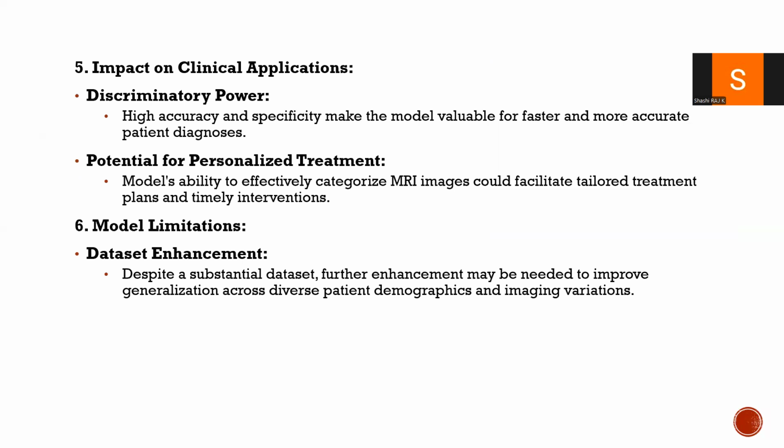The next, impact on clinical applications. Here, in the clinical application, there is the discriminatory power, potential for personalized treatment, and model limitations, that is, dataset enhancement. The discriminatory power, high accuracy and specificity, make the model valuable for faster and more accurate patient diagnosis. The model's ability to effectively categorize the MRI images could facilitate tailored treatment plans and timely interventions. For model limitations, from this substantial dataset, further enhancement may be needed to improve generalization across diverse patient demographics and image variations.